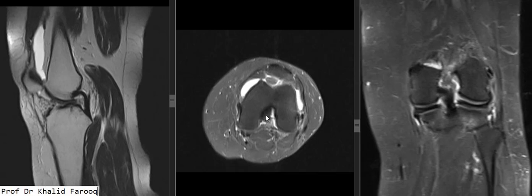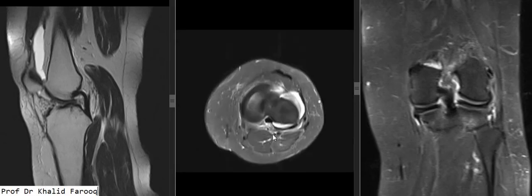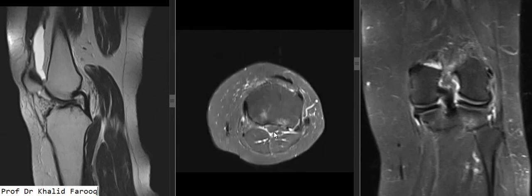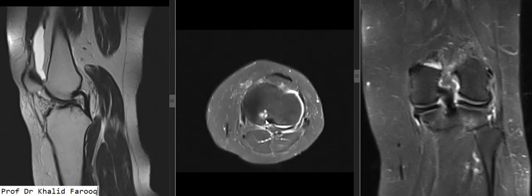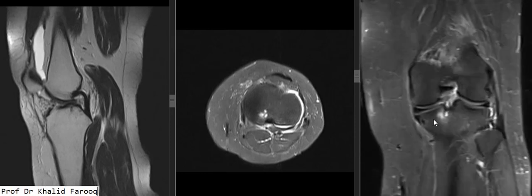This is the area of attachment on the medial femoral condyle. We can follow this — this is the mid portion, and this one is the lower portion. This is the level of attachment of the PCL on the tibia. Very tiny subchondral bone ulcers are also seen on axial images, and we can see these on coronal images as well.